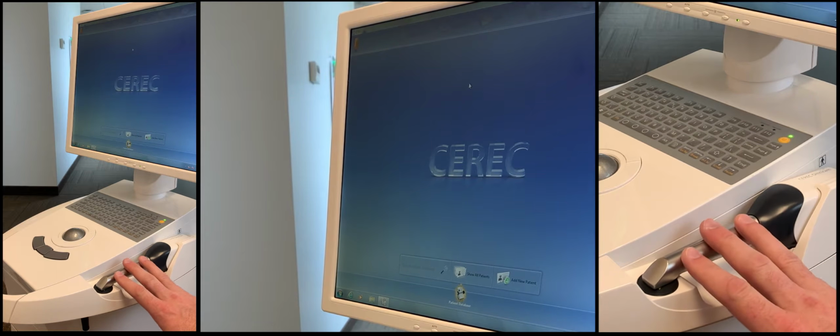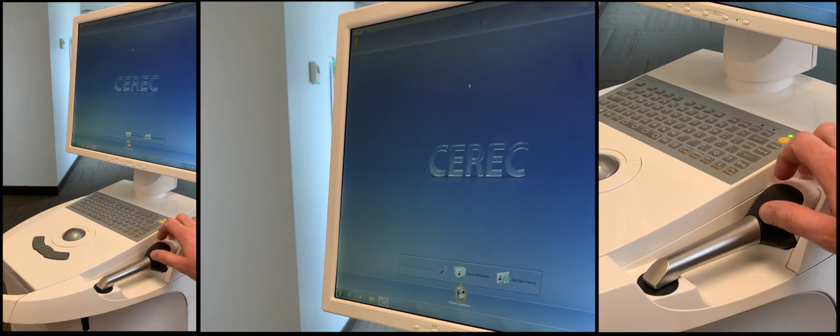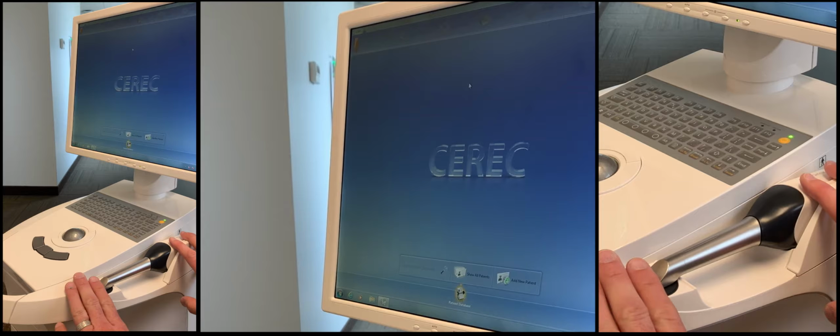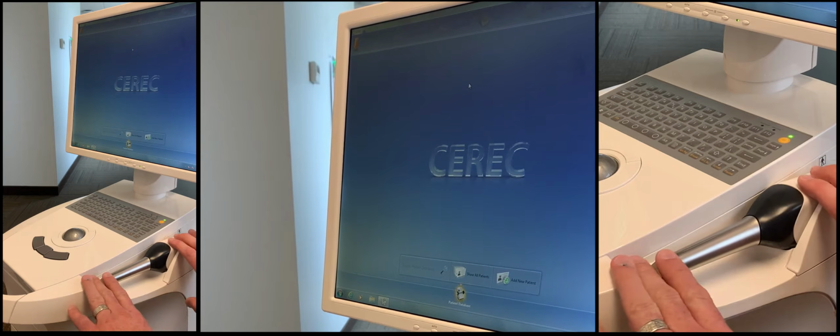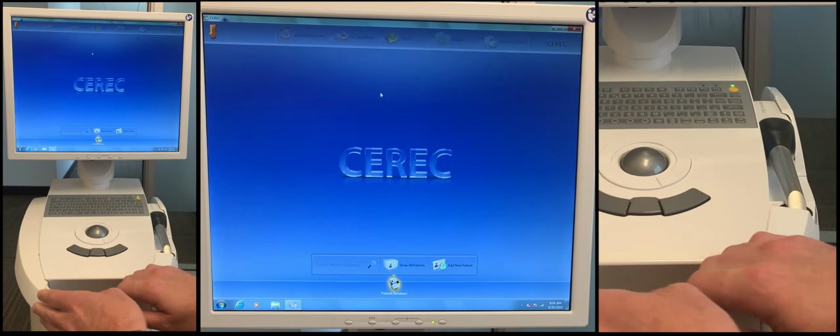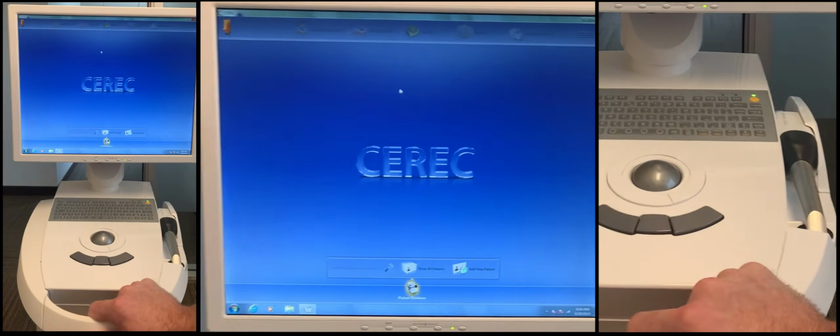That was about $1,200. The camera lens, I was told at the time, and it was a version that's different than this, would have cost about $12,000 to replace the whole camera. So be very cautious. Okay, so what are we looking at here?